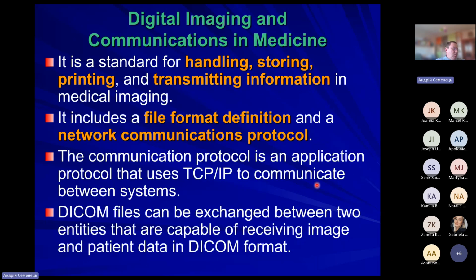And a few words about DICOM. It's actually a standard for handling, storing, printing, and transmitting information in medical imaging, and includes a file format and a network communication protocol. In fact, probably all modern medical diagnostic and imaging equipment has the capability to generate DICOM images.